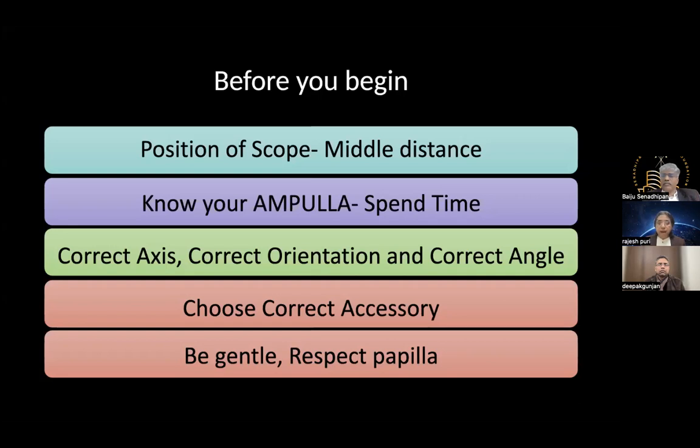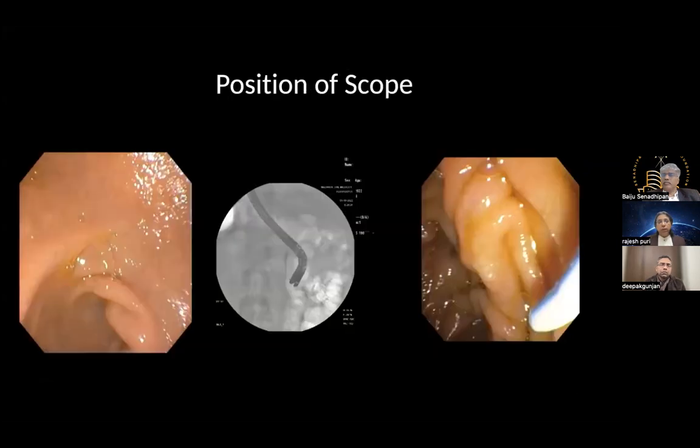I think with the pancreas, especially in a patient with a normal pancreas, when you are trying to fiddle with the ampulla, it is very important to respect it. If you don't respect the papilla, you may come across a difficult situation.